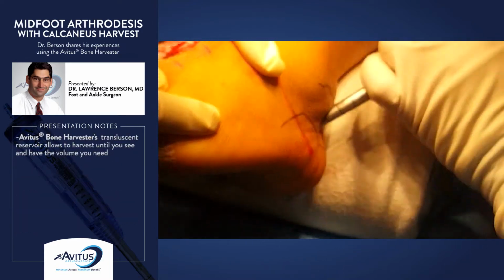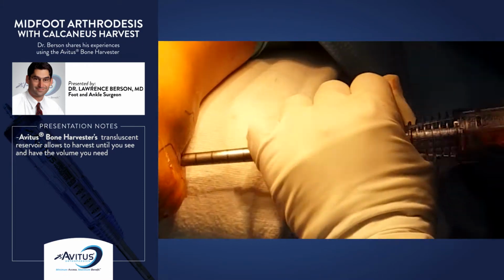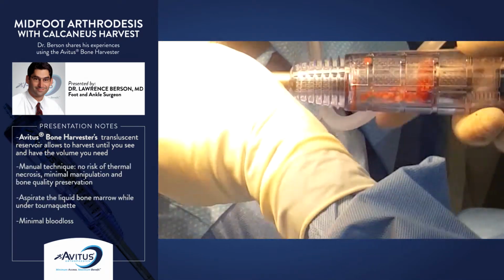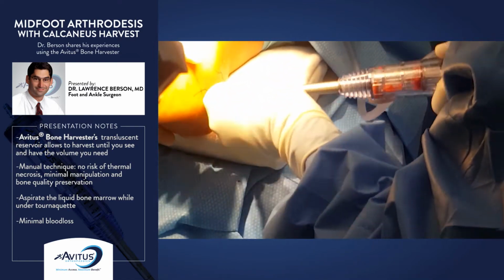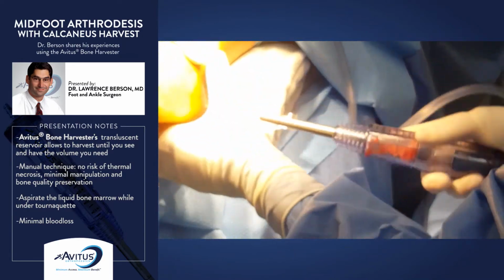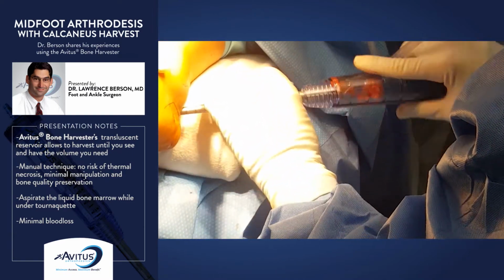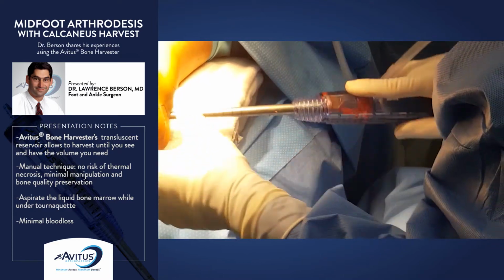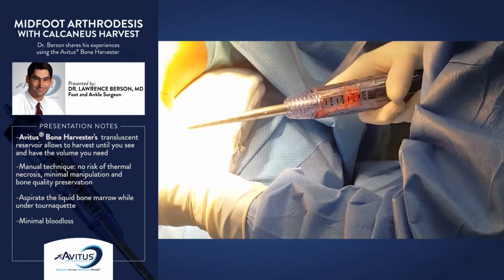It's nice also that the reservoir is translucent, so you can see how much bone you have. Obviously, you don't need to take more than you need. This is a manual technique. The risk of thermal necrosis to the bone or the osteoblastic cells is minimal. Once again, this is a manual, low-velocity, non-powered technique. Benefits, we also get the marrow with the suction device, so the bone quality and the bone health is superior.